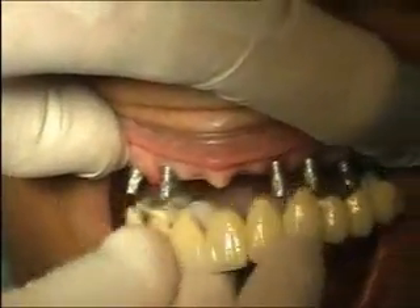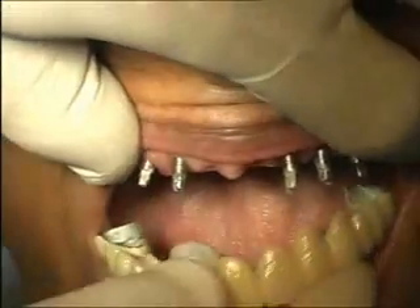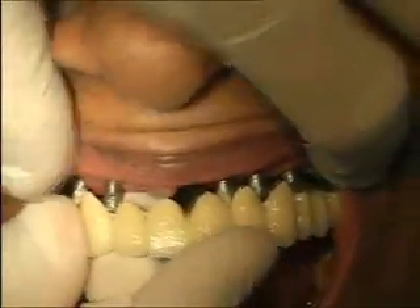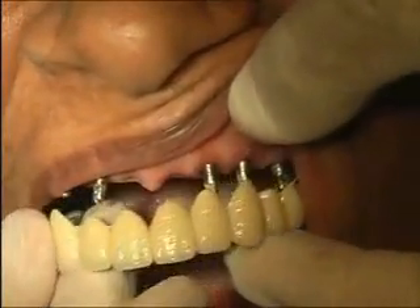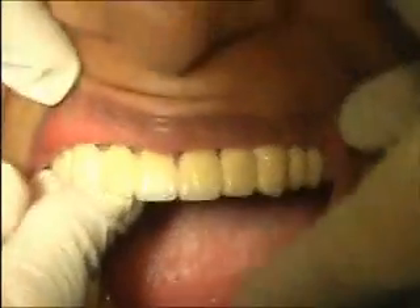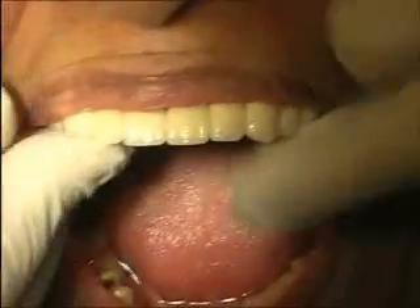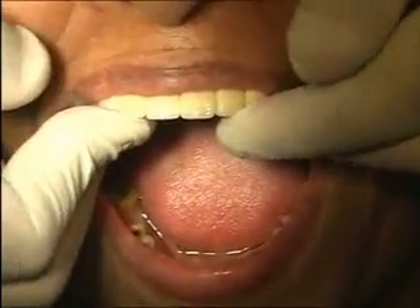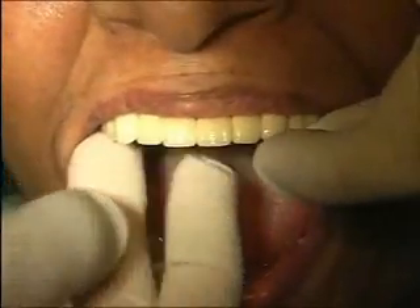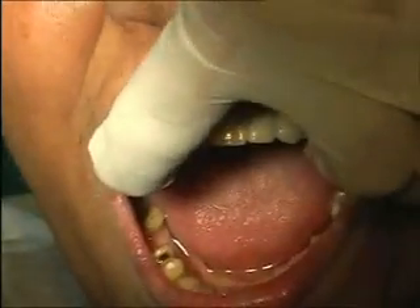You can do implantology in so many ways. Here we give ridge lap from inside — it's touching the implant but in this area the hygiene can be well maintained.